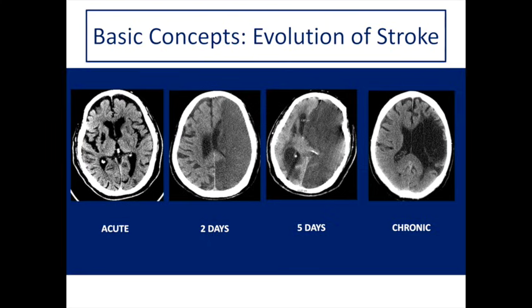Now, I covered this superficially so you can understand the basics. I suggest further reading or watching the Radiopedia video series on evolution of stroke if you want to understand this in greater detail. But this is more than enough for now.